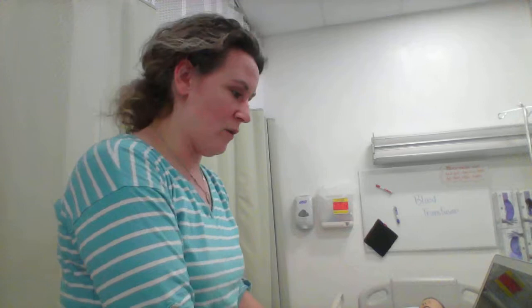Okay, so we're going to go ahead and look in the EHR, and we're going to verify the provider's orders. And we're verifying that Robert Crowley does indeed need 1 unit of red packed blood cells and he needs that now, because the time that was put in was 9 o'clock and it is now 9:25. So we need to have that administered now, and once we pick up the blood, we'll have it administered within the 30 minutes.